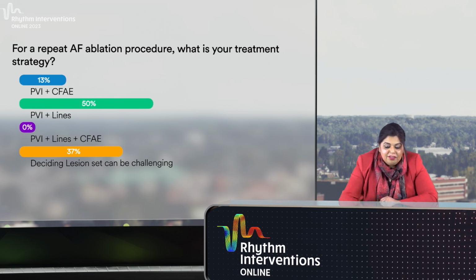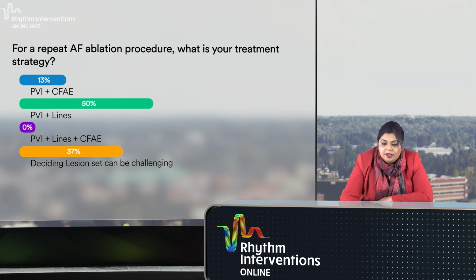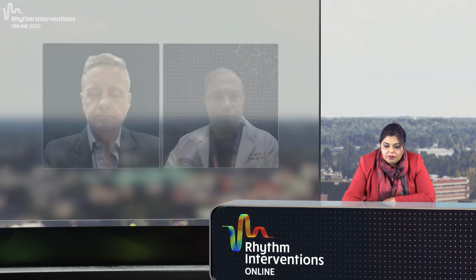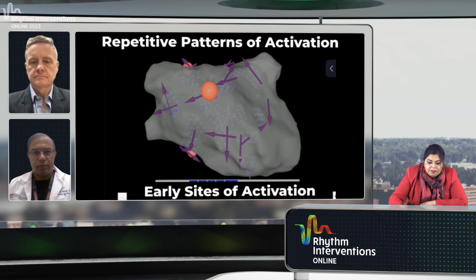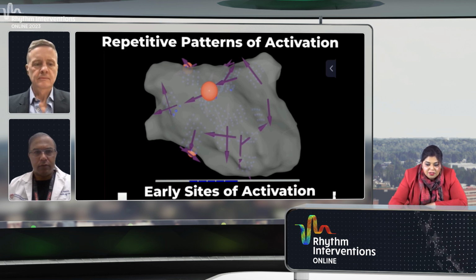And I think that's where I want to highlight this next part of this video series, to show what the map showed us. Can we please go back to the video here? Thank you. Right, I will go on. So Richard, here we're showing. Go ahead, Atul. Go ahead and pause that.